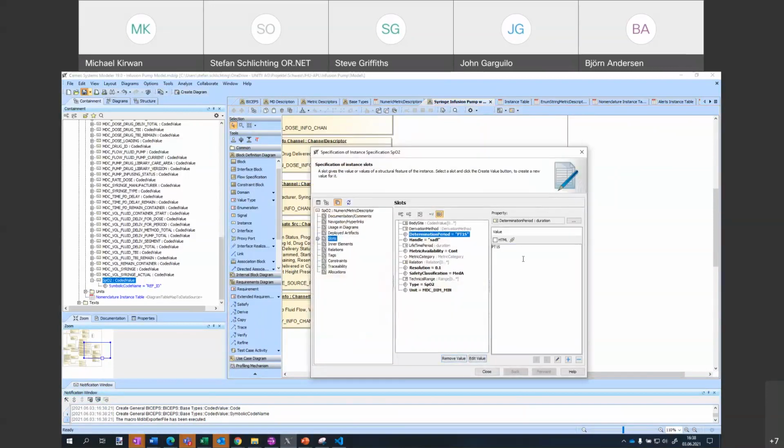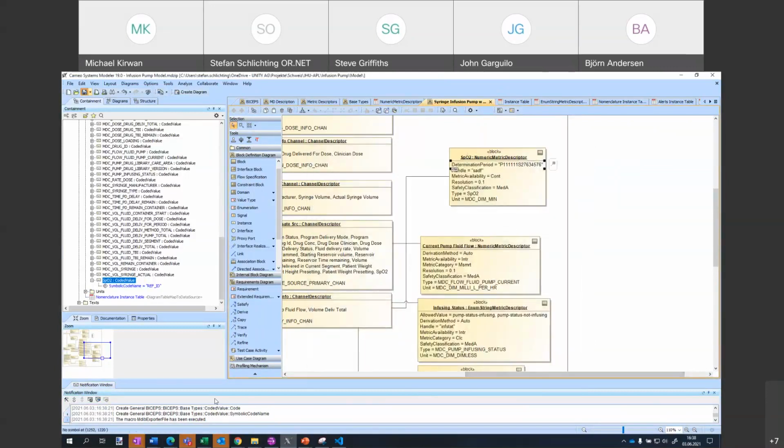And so for example, if I now mess this one up, oh no, that would be still correct. Probably this one is not correct. And generate it again.